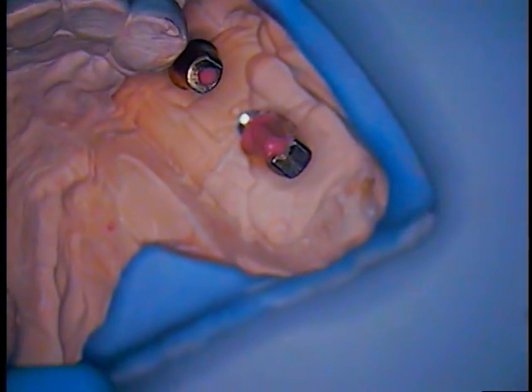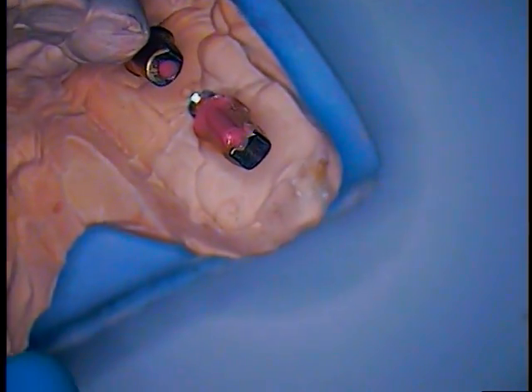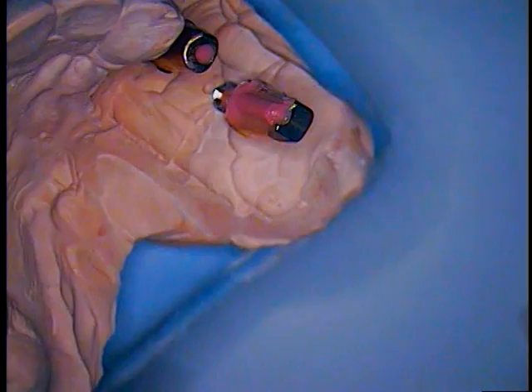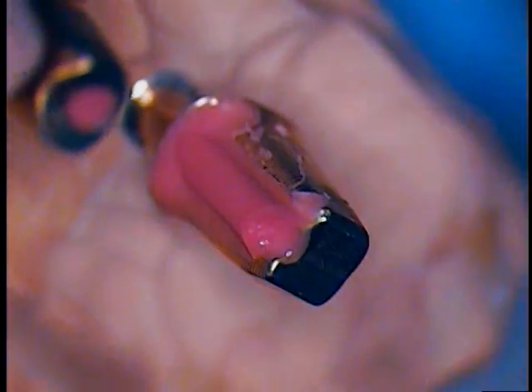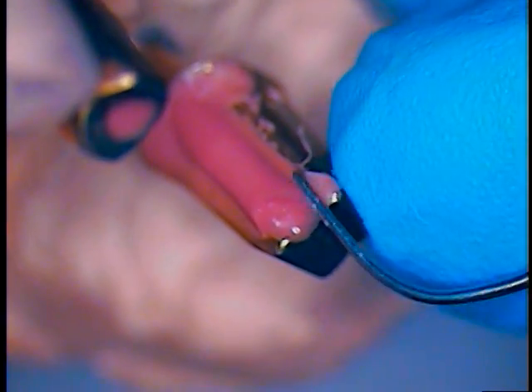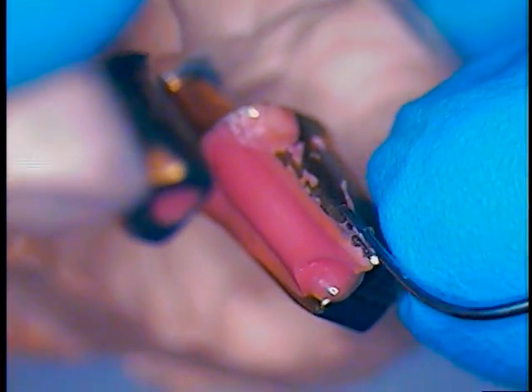We're back. Dr. Cuomo in his private office. We just removed this bridge. Now there's your block-out material. If you look real close, you can see I already started removing the excess flash. You'll be real careful — you don't want to create an opening here. So we're going to take a scalpel if necessary and just trim this very thin flash away.